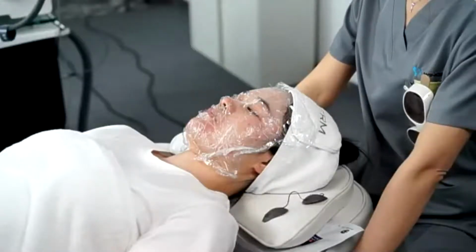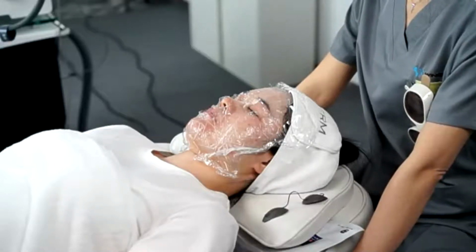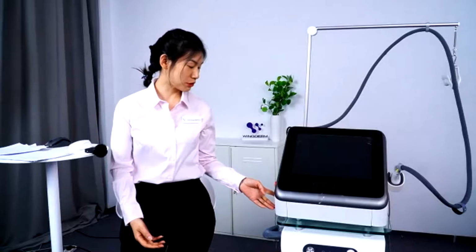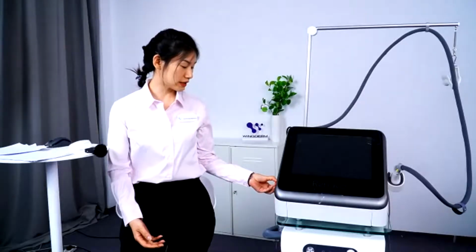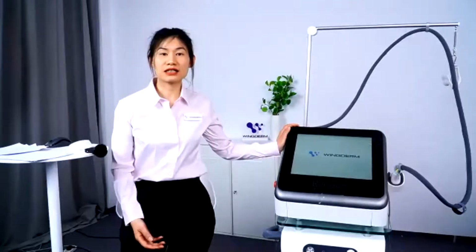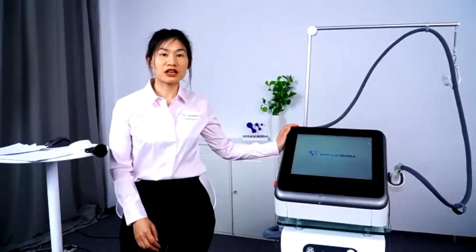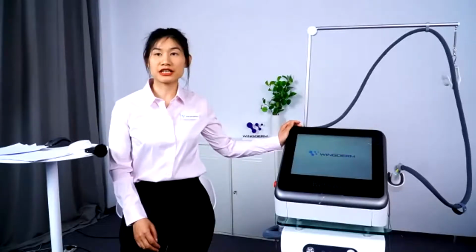For the clinical treatment, our model has already done the anesthetic. And now we'll show you the device here. Let's press the power button and release the emergency stop. The system will take around 30 seconds to enter the interface. And after you enter the interface, it will have the password you can enter.